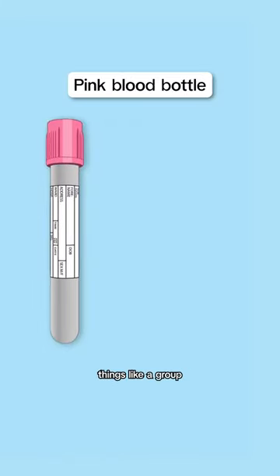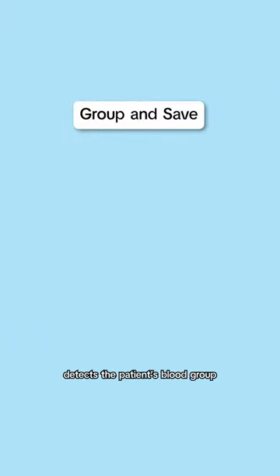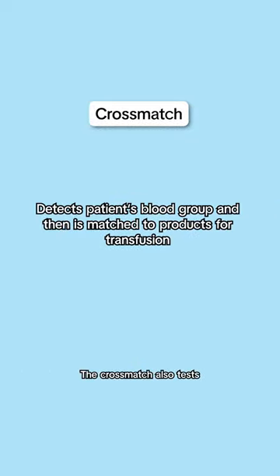The pink bottle tests for things like a group and save and a cross match, which you'll need to order if you're planning to give a patient a blood transfusion. The group and save detects the patient's blood group and then it's saved in the lab in case it's required in the future. The cross match also tests for the patient's blood group, but then it's matched to specific units of blood or other products of transfusion.